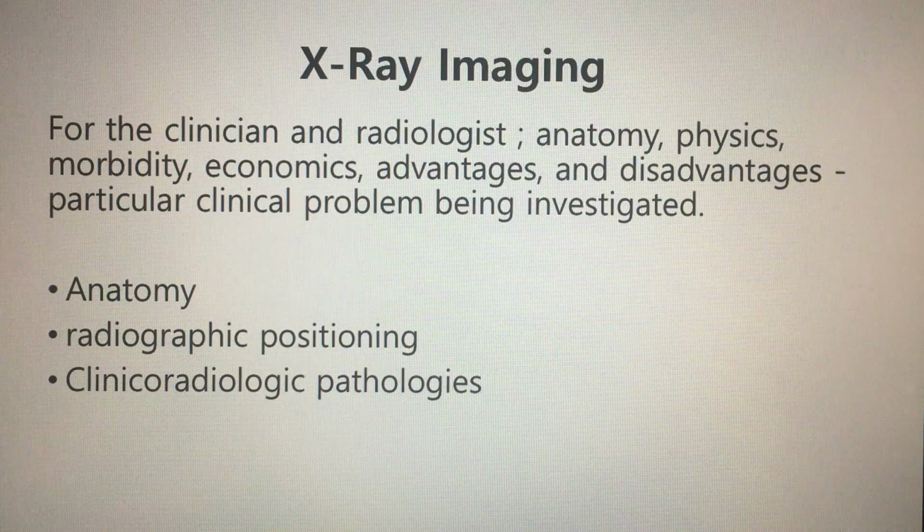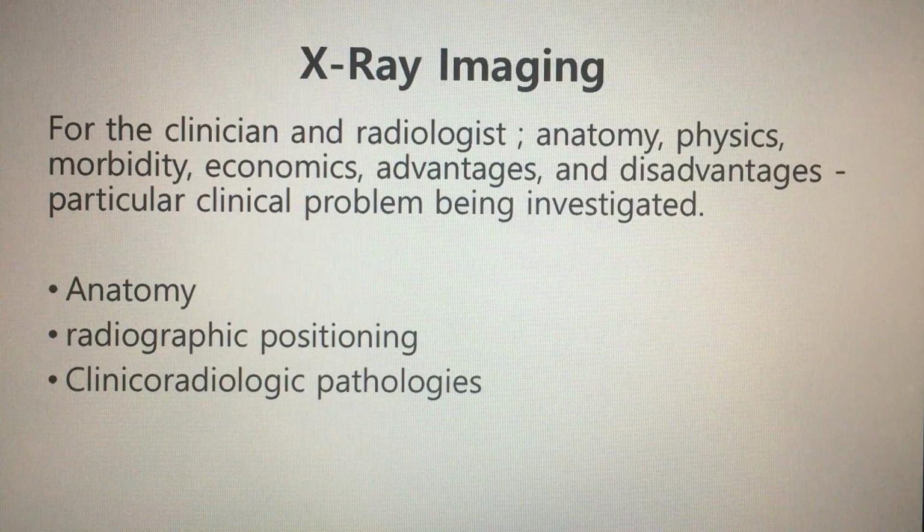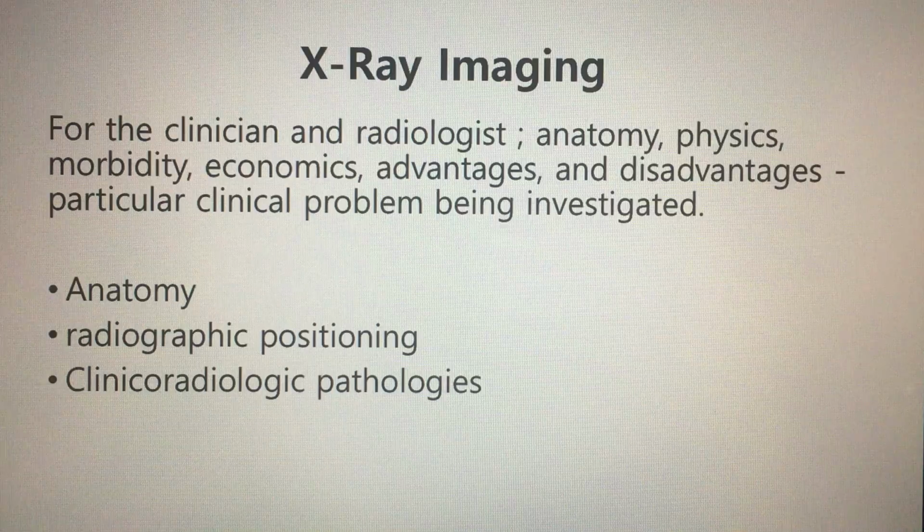For X-ray imaging, clinicians and radiologists should know anatomy, physics, morbidity, economics, advantages and disadvantages, and the particular clinical problem being investigated. So we must know at least anatomy, radiographic positioning, and clinical radiologic pathologies.